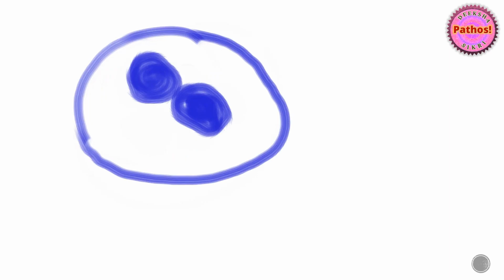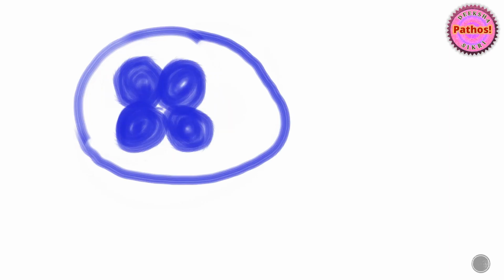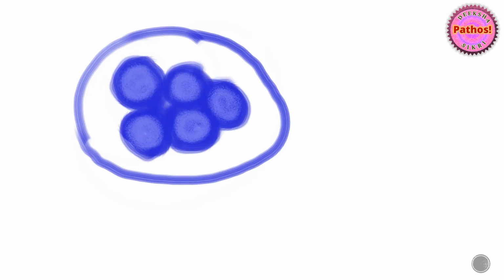This is the nucleus. This is the cell infected with HSV. You can see it's going to undergo multinucleation. So that's the first M. It looks like the nuclei are molded together, and then the chromatin gets pushed to the periphery. So there's chromatin margination. So those are your 3 M's.